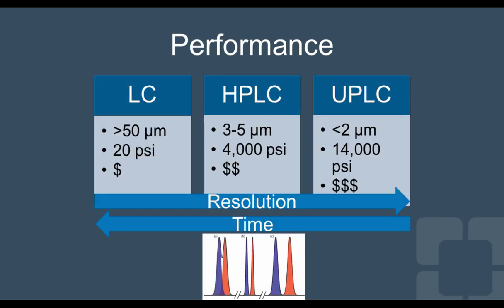In the clinical laboratory, we don't perform column chromatography. Maybe some labs used to perform thin layer chromatography, similar to the pen and paper experiment, but we're helping with machines to get the separation we need. So we have liquid chromatography here on the left. It uses large diameter stationary phase or particles, which does not require much pressure to force the mobile phase through the stationary phase. To the right of that, you have high performance liquid chromatography.